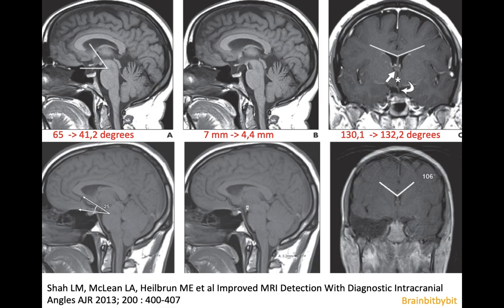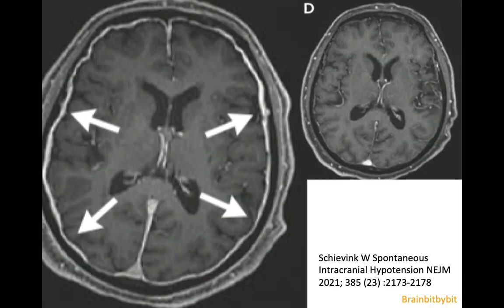If you don't have much experience looking at images of the posterior fossa, doing some measurements might be helpful. In patients with intracranial hypotension there are several measurable abnormalities: for example, the pontomesencephalic angle decreases, there is a smaller distance between the mammillary bodies and the pons compared to normal patients, and there is a different angle between the lateral ventricles, though this difference is not significant. On post-contrast imaging, you may also see dilation of the vessels.